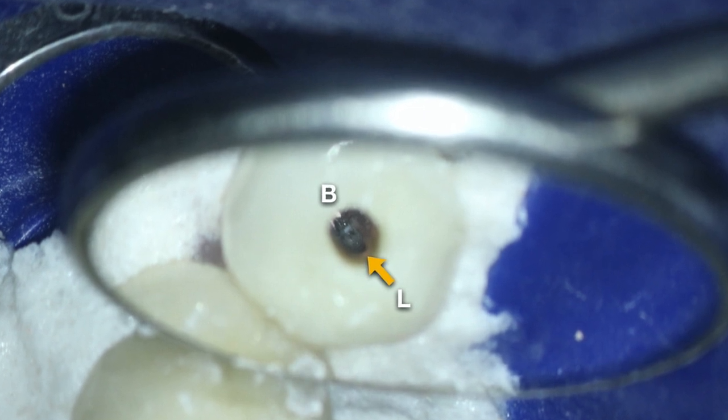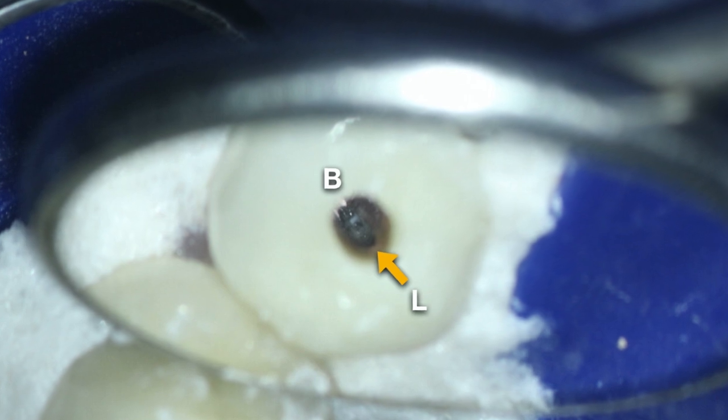The gutta percha has been removed, the file has been bent and measured to the target vertical depth, and it's placed. Look at this file approach — the angulation, how far I'm coming in from the buccal. The file has a little bend on it so I can get it into that acute branch from the buccal canal. Once I have the file in the canal, I try to open that canal orifice as much as I can so I can reproduce that access the next time. I use hand files for initial orifice enlargement when dealing with bifidities because I want that ultimate tactile feel and control. I'm not taking larger hand files of 15s and 20s to length — I'm merely using them to open up the orifice level. Once dentinal constrictions are removed a bit, the need for pre-bending decreases and you can apply them with no bends.